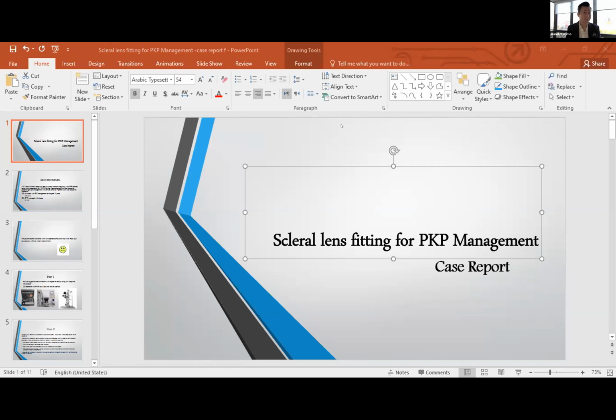What I can say is we've seen a big change in the volume of fogging patients when we have an appropriate landing. And since switching to a toric landing lens, that's really helped with the fogging. So that's something I might try.